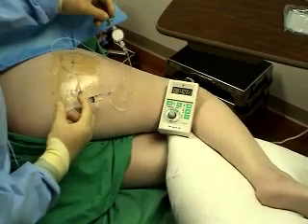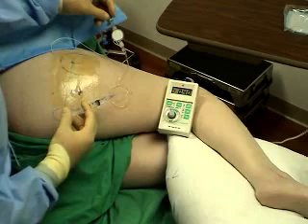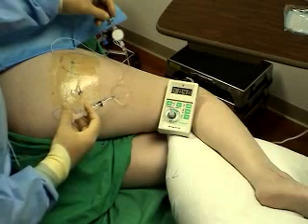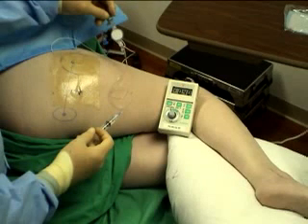The snap lock is attached to the catheter and the nerve stimulator to the snap lock. The nerve stimulator output is turned up until brisk muscle twitches can just be seen. Immediately upon injection of the local anesthetic agent, the twitches will disappear. This constitutes a positive Raj test, which gives final confirmation that the secondary block will be successful.